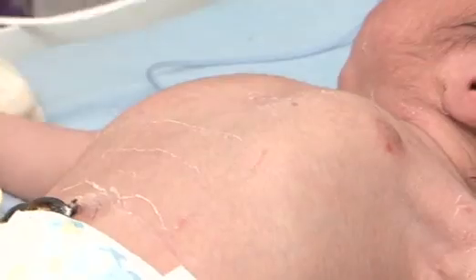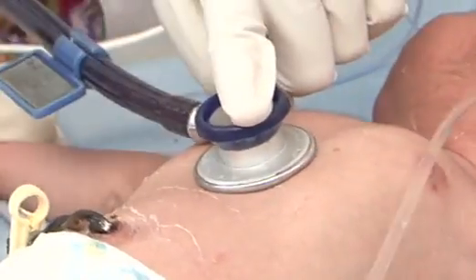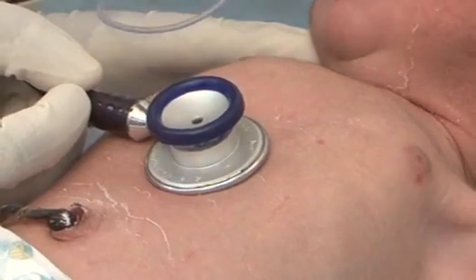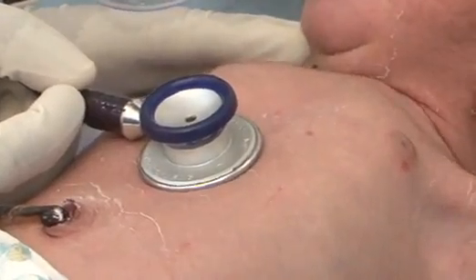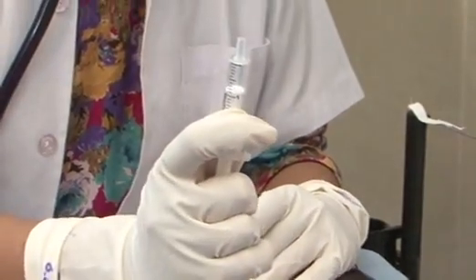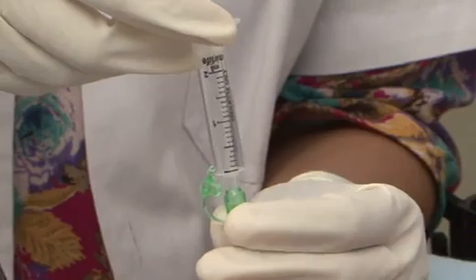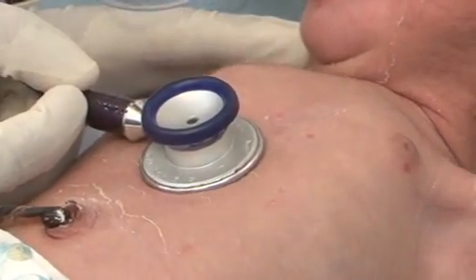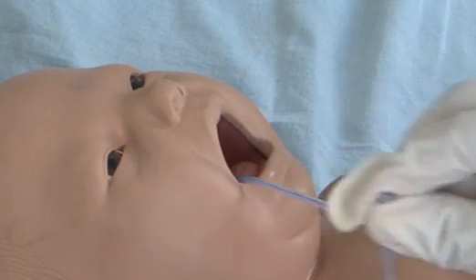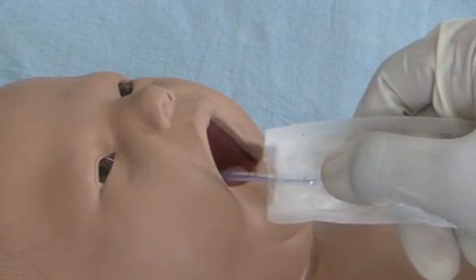Check correct insertion of the tube by placing a pediatric stethoscope just below the xiphoid sternum slightly on the left side of the upper abdomen. Attach a syringe and push 2 to 3 cc of air to auscultate for the sound of a gush of air. If no sound is heard, withdraw the tube immediately and try re-insertion or call the doctor.